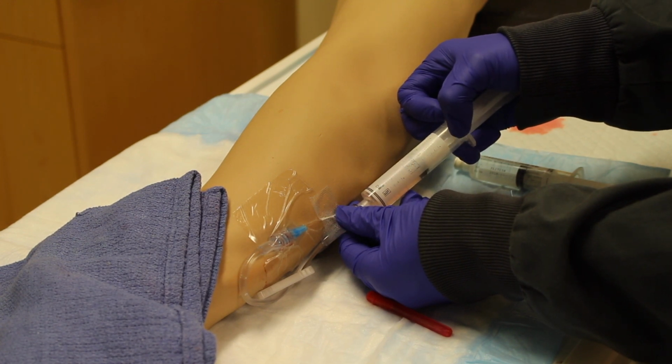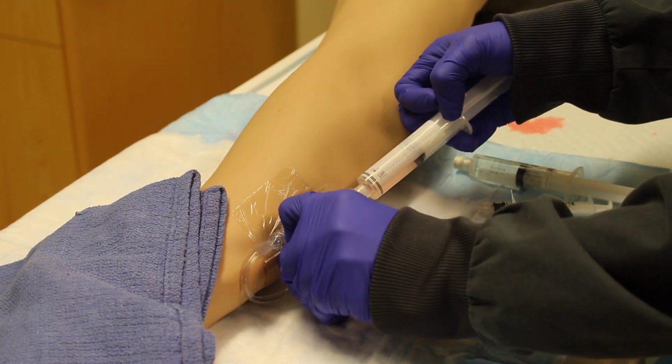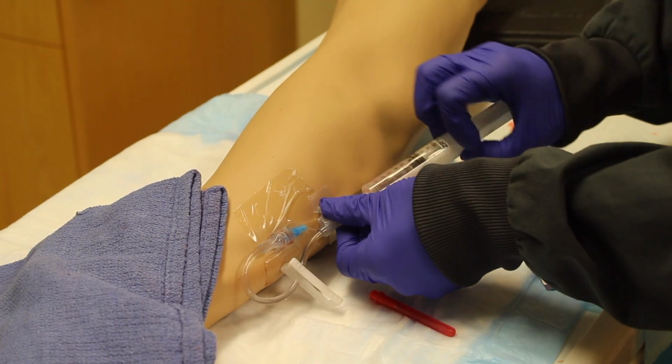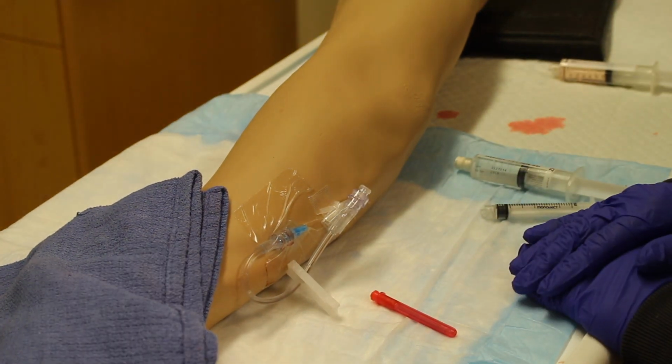Lock the extension tubing when complete and dispose of supplies safely. For both administration techniques, observe the patient for reactions to the medications and complete the ending 4 tasks.